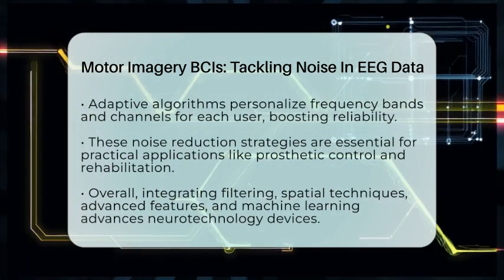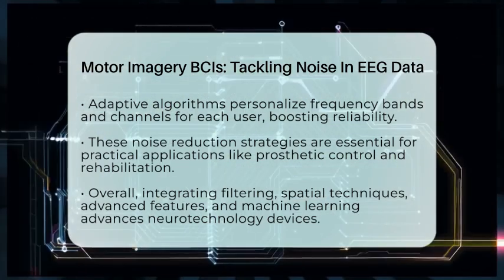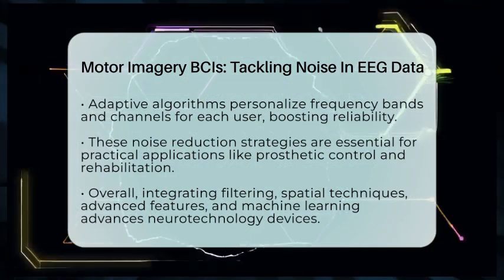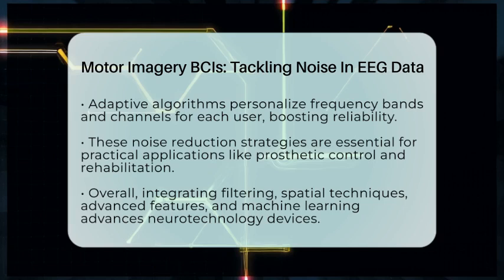Since EEG patterns vary a lot from person to person, adaptive algorithms are important. They customize the frequency bands and channels for each user, reducing the impact of noise and improving overall performance. This personalization makes the system more reliable for practical use.